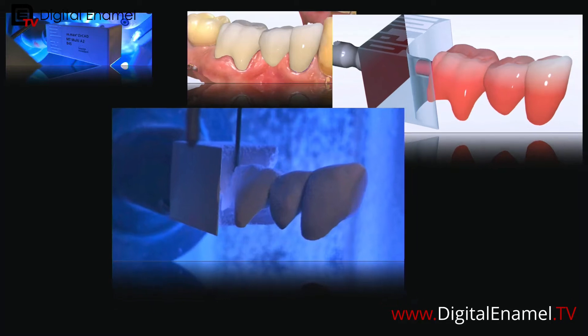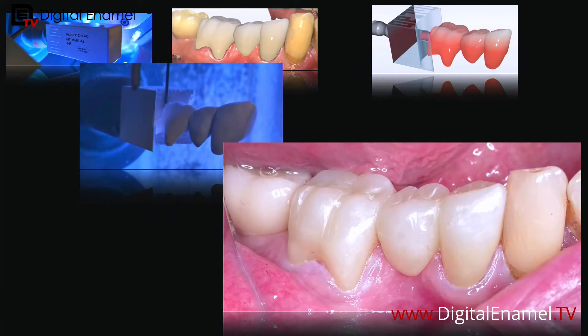Get yourself a dry milling unit — maybe even the Prime Mill. So this is the restoration. I'm not going to go through all the design because I did that in a long video on Digital Enamel TV, but tonight I'm going to talk about the modified ridge lap on that premolar: how to design that section and also how to design it so the patient isn't getting food up underneath that pontic.